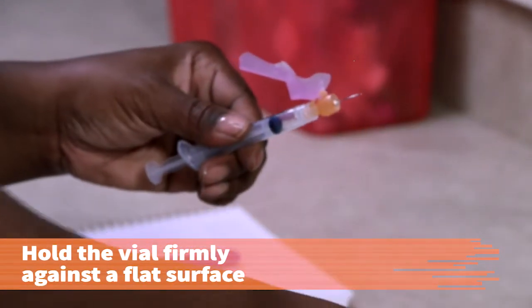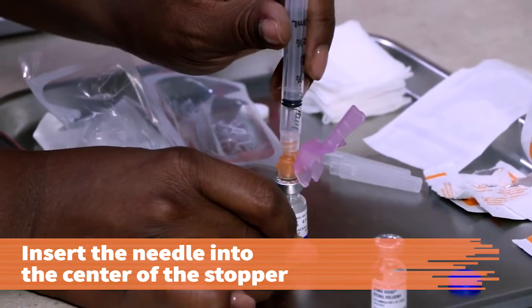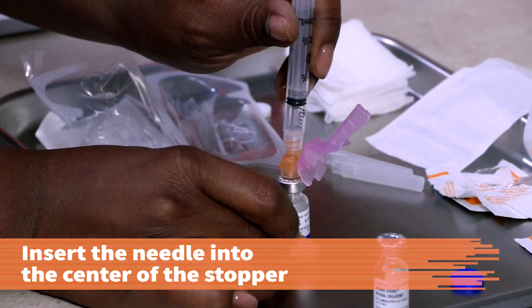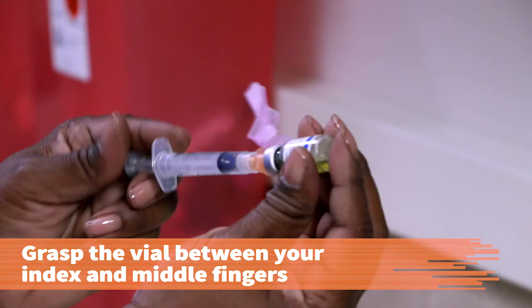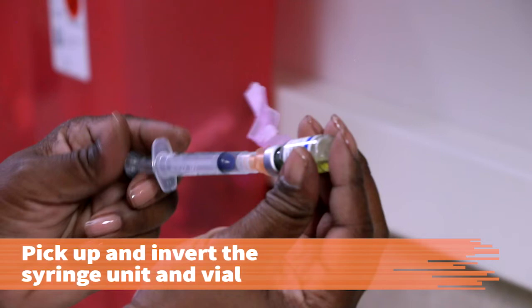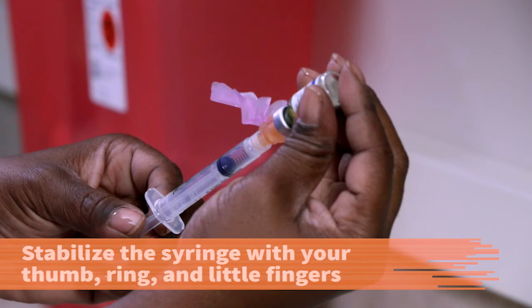Hold the vial firmly against a flat surface. Insert the needle into the center of the dried rubber stopper. Inject the aspirated air above the fluid in the vial. With the palm of your non-dominant hand facing upward, grasp the vial between your middle and index fingers. Keeping the syringe unit in the vial, pick up and invert them. Use your thumb, ring, and little fingers of your non-dominant hand to stabilize the syringe in the vial.